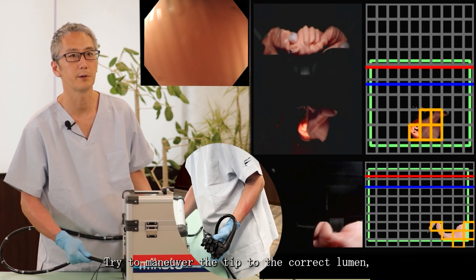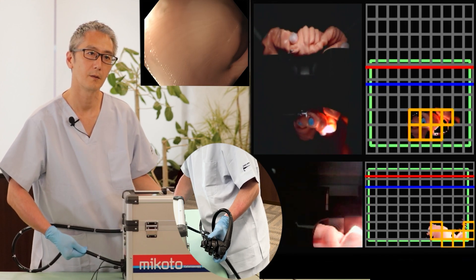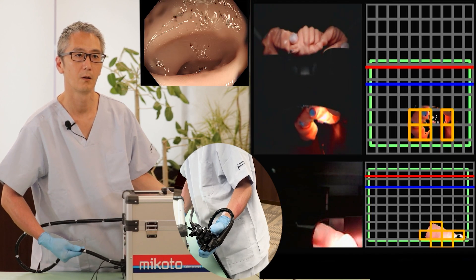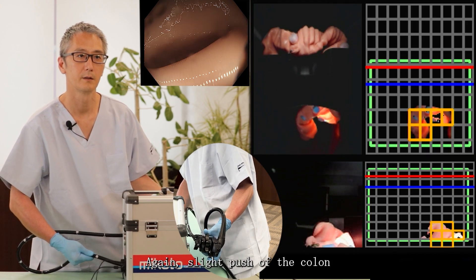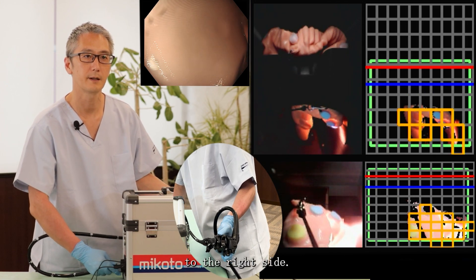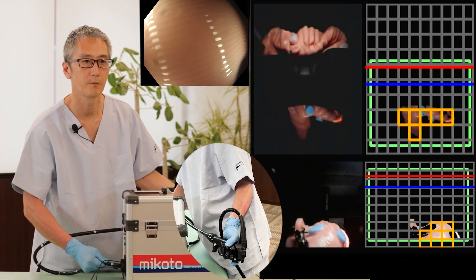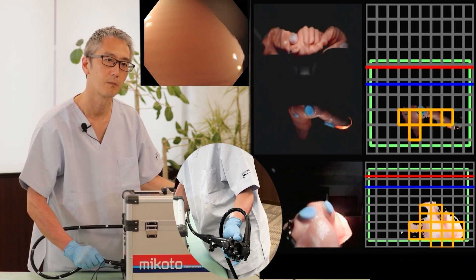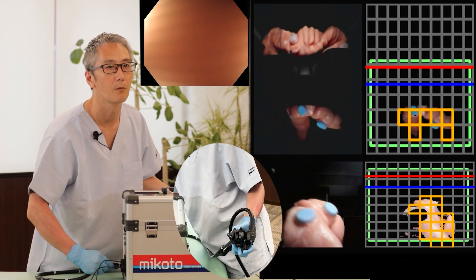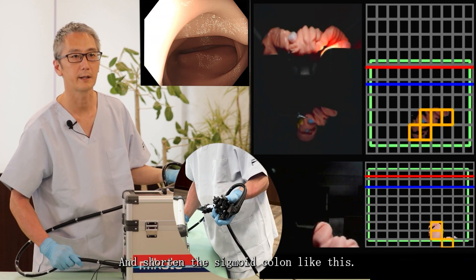Try to maneuver the tip to the correct lumen opening to the right side. Apply a slight push of the colon to the left side, and shorten the sigmoid colon.